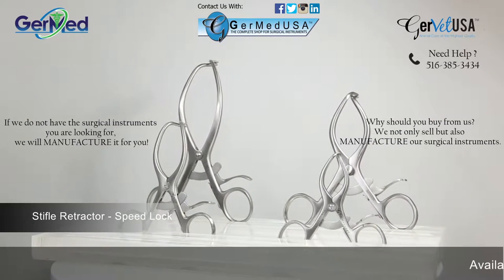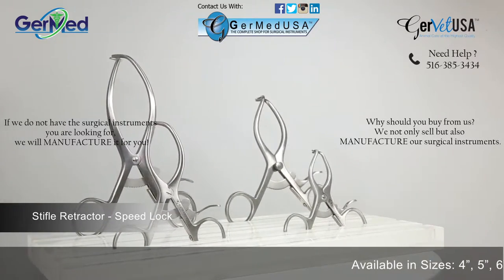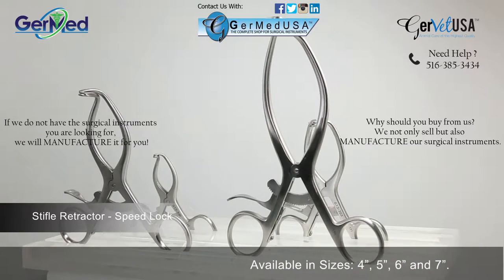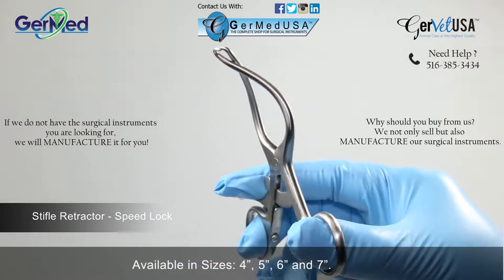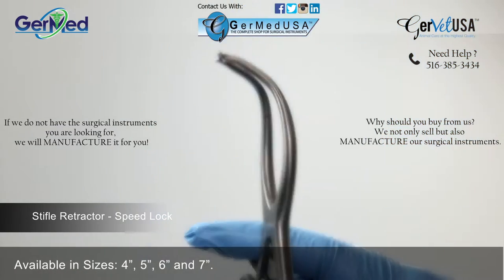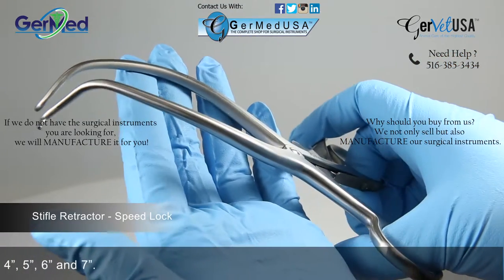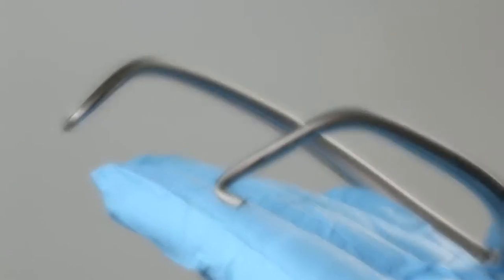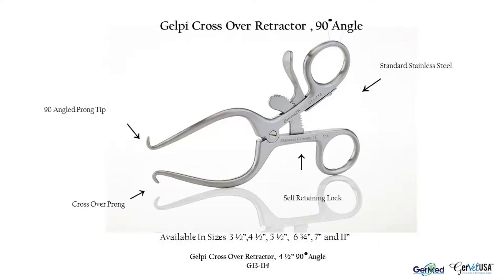GermEd provides Gelpy crossover retractors in a variety of lengths in order to correlate with the size of the patient. Gelpy crossover retractors are a ratcheted finger ring instrument used to hold back underlying organs and tissues to access the body part under incision. They are available in standard angle, deep angle, and 90 degree angle, and in sizes 3 1/2, 4 1/2, 5 1/2, 6 3/4, 7, and 11 inches. The crossover feature provides an easier insertion.